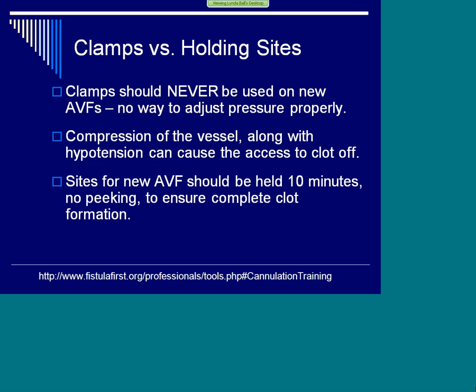Now, clamps versus holding sites. On brand new fistulas, never, I repeat, never use clamps.